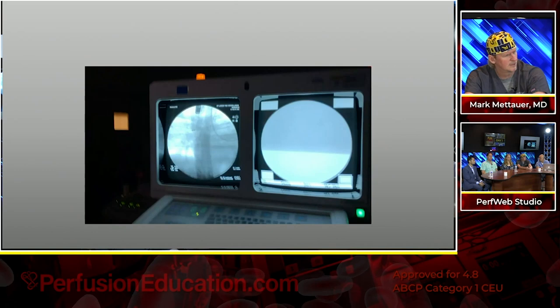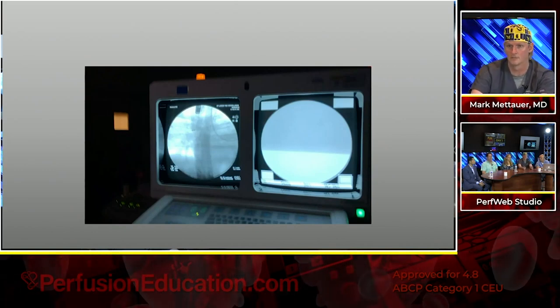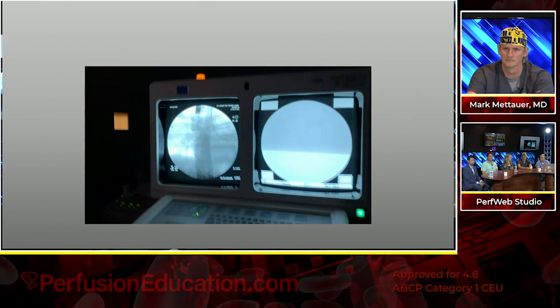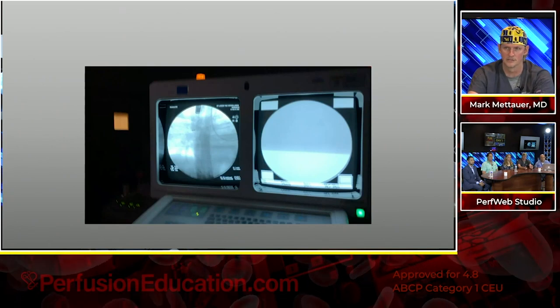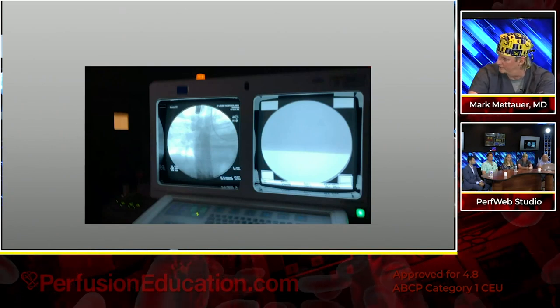And I think, did we talk about that in the previous? We did. So we're prepared for VA ECMO in case this, God forbid, breaks off, or if they just need full cardiac support along with oxygenation. We can also, just if they need oxygenation, convert to a VV cannula if their cardiac performance is fine and they don't need offloading.